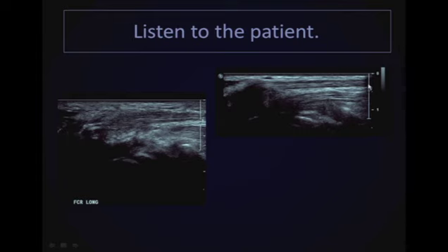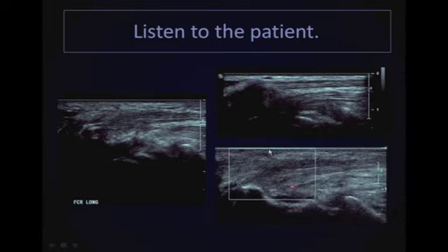In the other wrist, you can see that the normal architecture and normal ultrasound appearance persists through the whole tendon that we are imaging. We don't see thickening like we do see here. We can also use Doppler and see if there's any increased flow. We probably were scanning with a little bit of a heavy hand here, but there was increased vascularity in this area. And this is insertional tendinosis or tenosynovitis of the flexor carpi radialis.